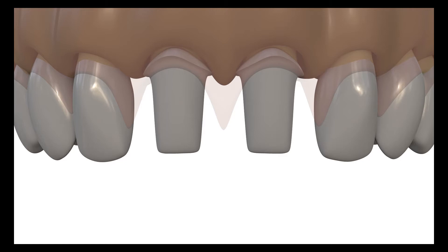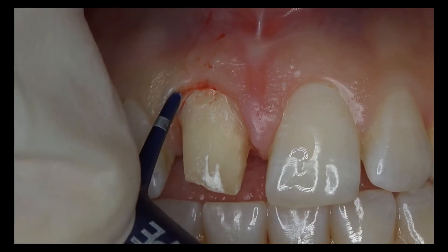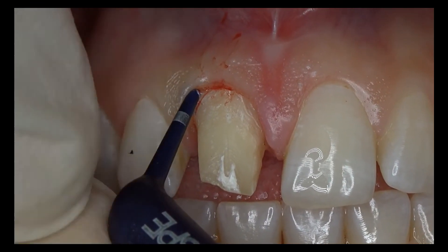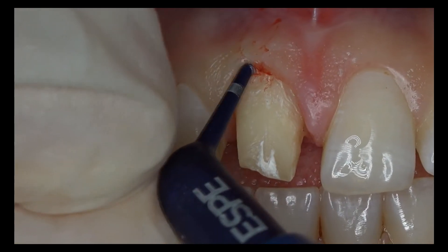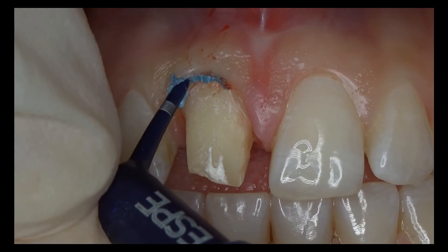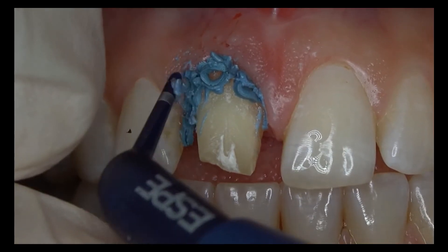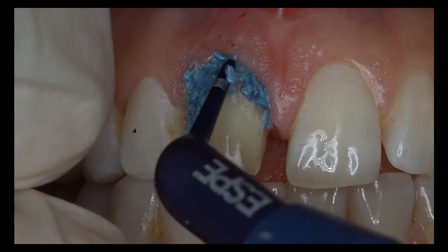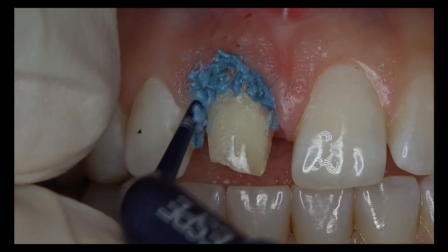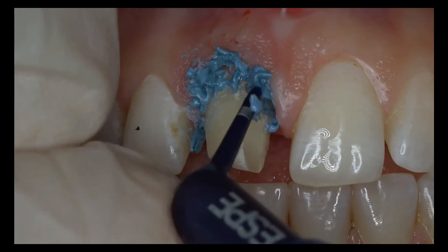First, a non-traumatic retraction is made. For this purpose, an aluminium chloride containing astringent paste is injected into the sulcus and left for 3 minutes. It is also placed over the gingival to obtain additional gingival retraction. These pastes do not injure the junctional epithelium and thus do not cause irreversible gingival recession in the long term, making them more advantageous than cords.